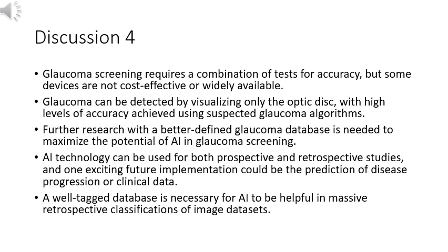The accuracy of CNNs appears to be related primarily to two factors. The first factor is the similarity of classes, and the second is the number of well-classified images. Regarding the first factor, it is necessary to explore the use of deep learning for fine-grained image classification techniques, given that it is easy for CNNs to differentiate a horse from a car, but the complexity increases when considering the classification of similar images. Concerning the second factor, it is easier to obtain high levels of accuracy if we have large and well-classified data sets.